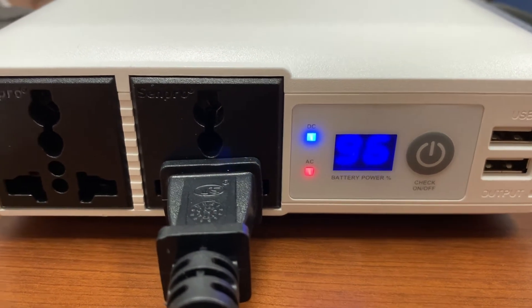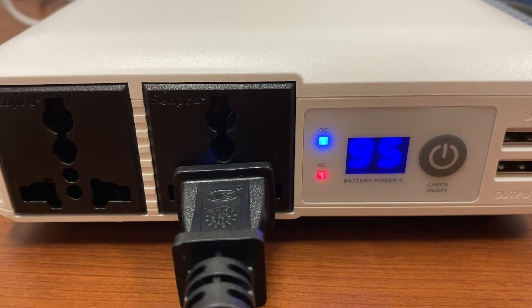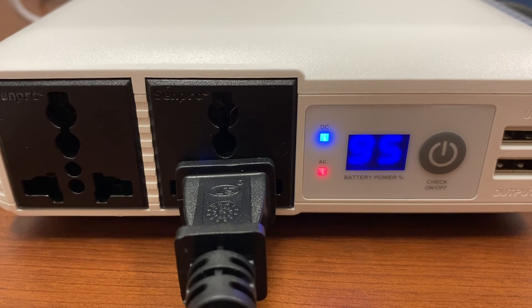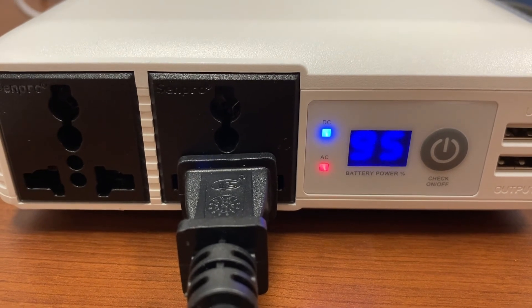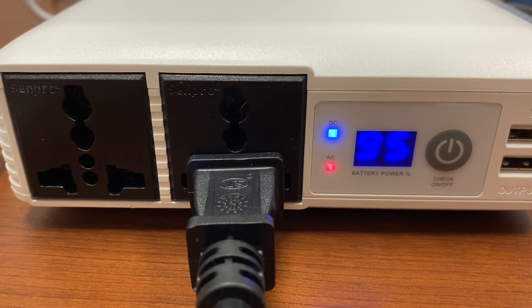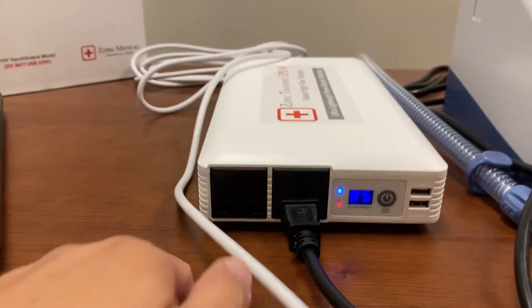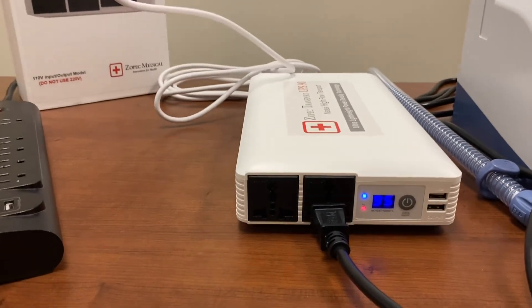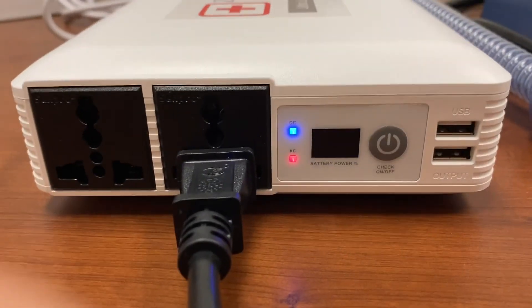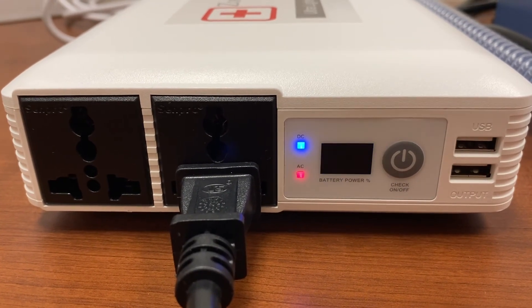Let's pretend that we had gone out for an hour with the patient and the percentage is much lower. The key is that when we come back, we want to plug it back in and it charges back to 100%, so it's ready for the next transport. Let's pretend that we're back and plug it in. You can see that it's flashing again and it's starting to charge back up.